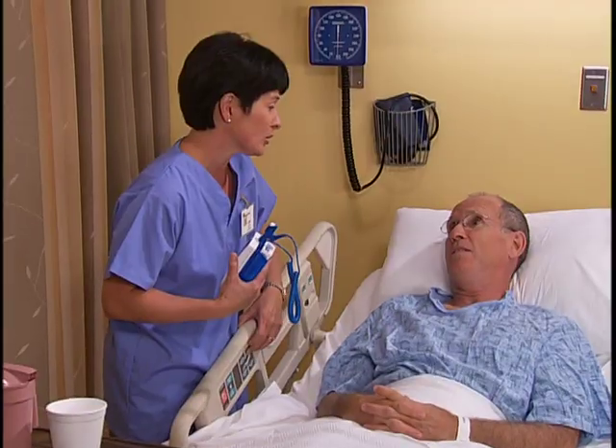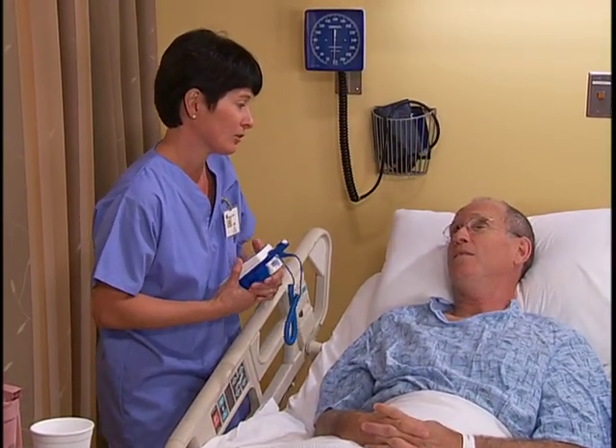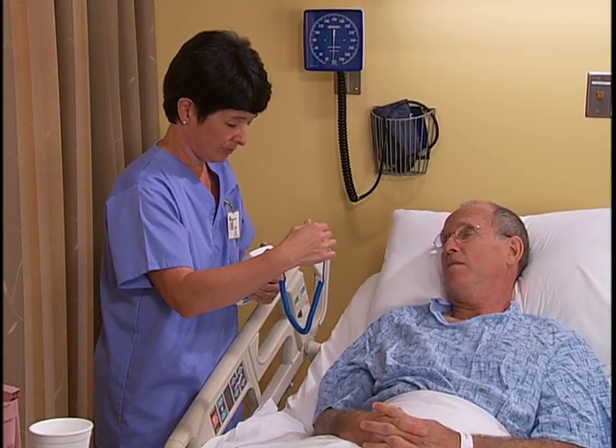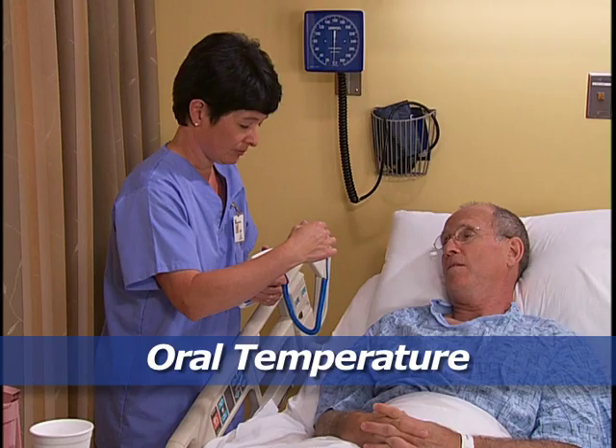Have you had anything to eat or drink in the last 30 minutes? No. Assess for any factors that might interfere with accurate temperature measurement, like consumption of hot or cold liquids as much as 30 minutes before taking an oral temperature. When taking an oral temperature, wear gloves if required by agency policy.